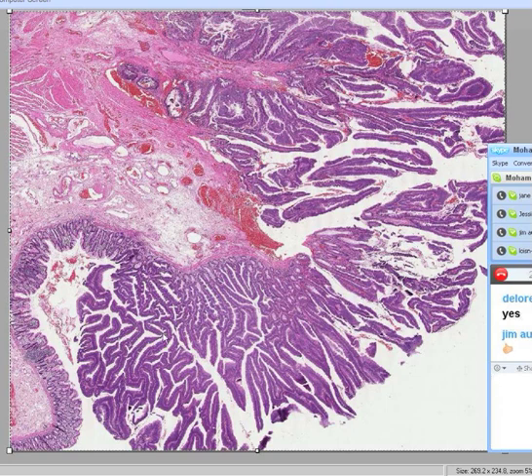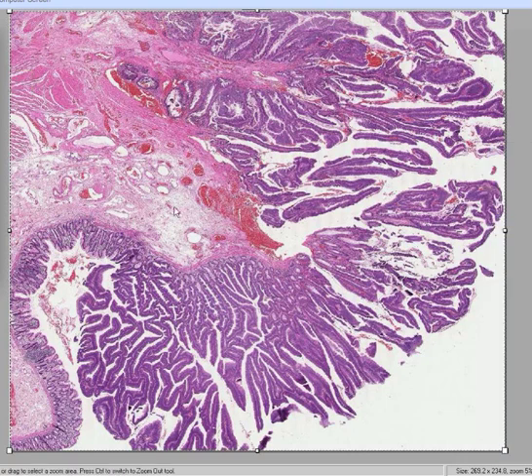And then look, all of a sudden, this mucosa shows tremendous growth, doesn't it? It's thickened to maybe 10 or 20 times as much as it should be. And in addition to that, I'm assuming you're all in focus now, there's something else I want to show you about this, because I'm going to blow this up one more power.